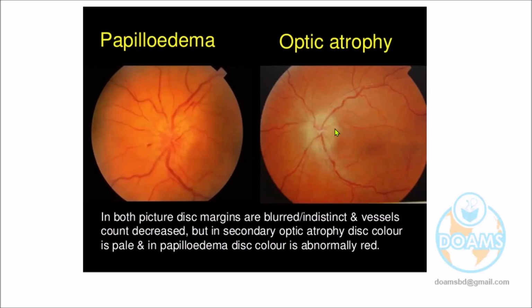If the supply to the artery is blocked, the whole retina will be whiter, the whole retina will be pale. Not only there. But the paleness here is actually damage to the optic nerve.